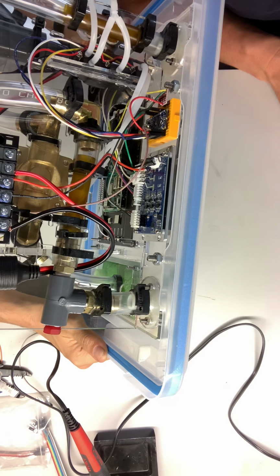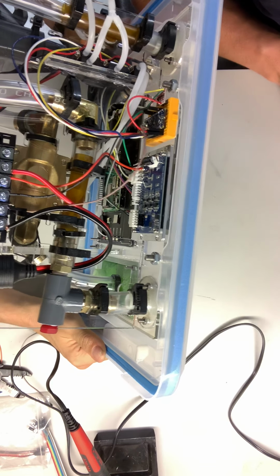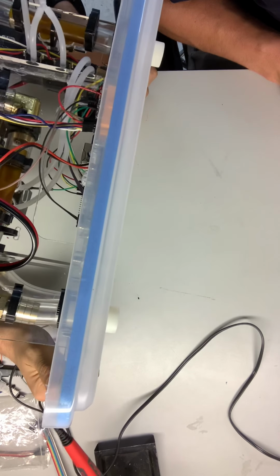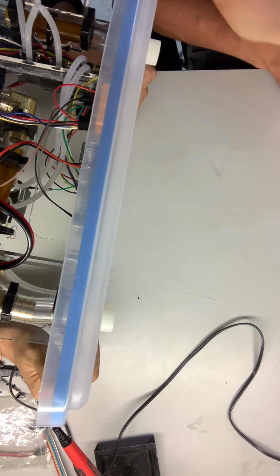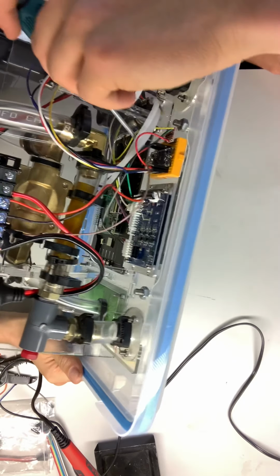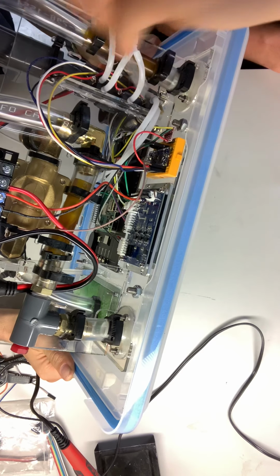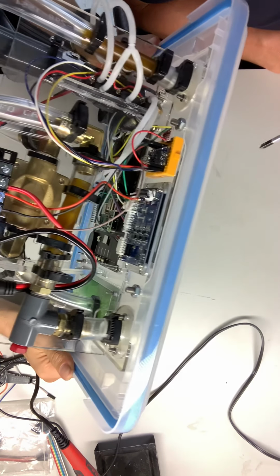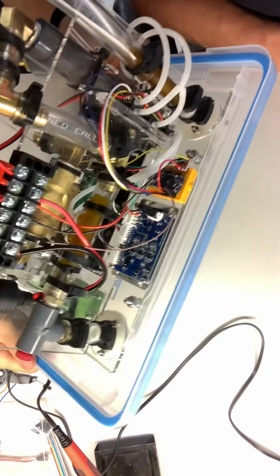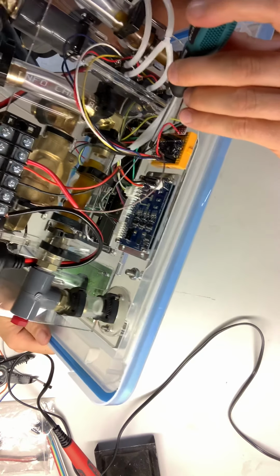Yeah, okay, good. So that solenoid driving pin is purple on the diagram. It is 1, 2, 3, 4, 5, 6 pins down from the other side of the Arduino, and it's green in the physical here. So what do we have? 1, 2, 3, 4, 5, 6. 6. Cool. 6. That's kind of hard to see. Yeah. Good luck. It's there. We have no reason to lie to you.